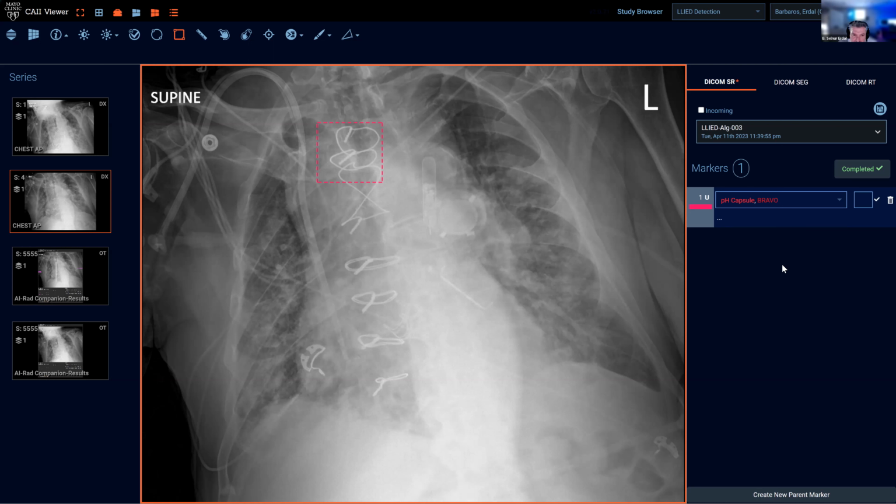Seeing is believing. The idea is to give the results to end users, let them give the feedback, let them label the data for you, because their feedback is most important. In a traditional setting, if it takes me 2 minutes to evaluate this patient, then I go to yet another station to label the data. No one's paying radiologists for that. That's a lot of time spent. They already looked at the case in a clinical setting, so they need to be able to give feedback right there and then. Making a call here, saying yes, I approve this, or giving a score to it, takes me 1 second, versus refining the information and doing it again in a different setting, another 10 minutes maybe to put it all together.